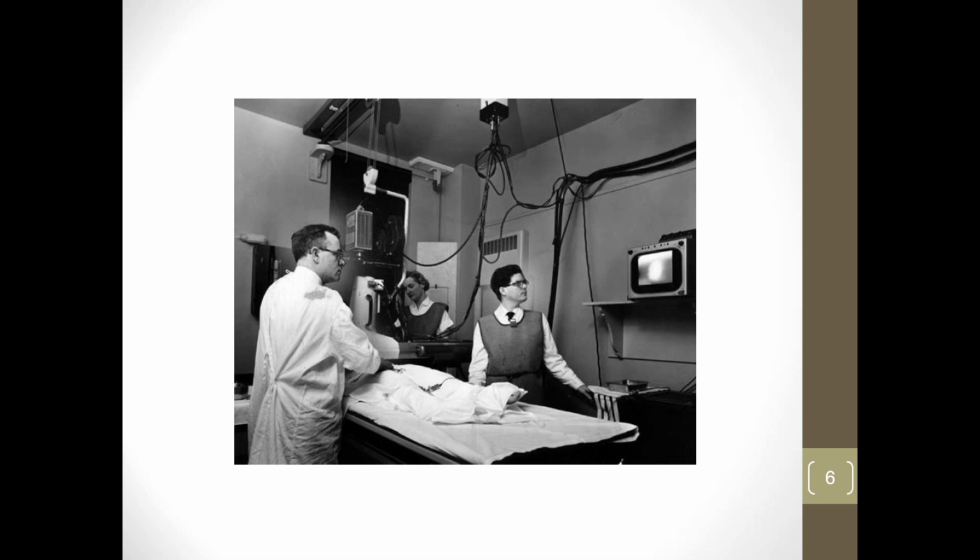But with 1950s technology, they didn't have anything better. Here's the image intensifier, which we'll be covering later. And up here are the cameras for the system. One is the camera that shows the image on the screen, and the other is your cine camera that they use to actually record the images so that the physician could go back and look at them.